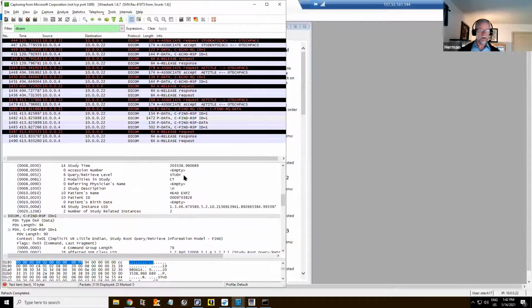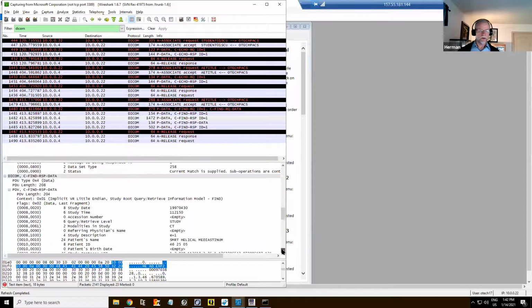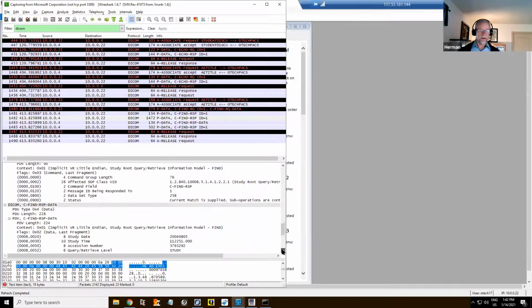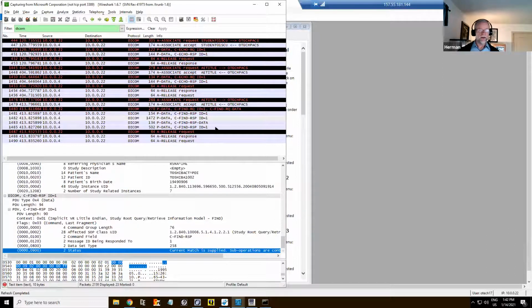Okay, we got here CT, right, with this name. Status pending, right? The next one. Let's get another one and another one and another one. And then all the way in the end, right? Get a pending, then we get the success. So that's the cycle for a typical workstation query.